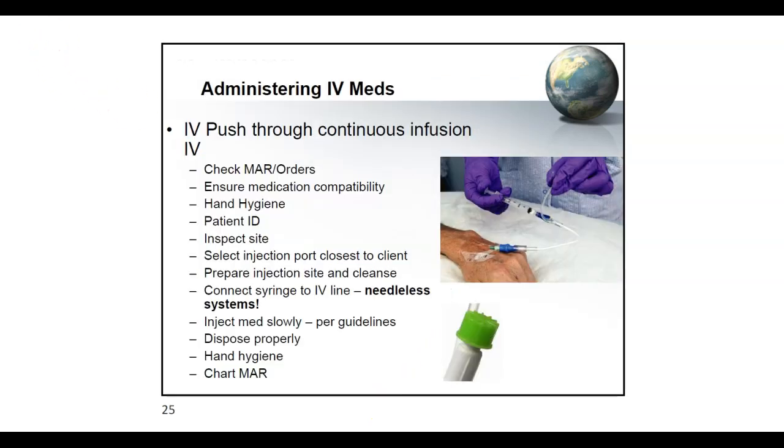Next, let's talk about administering IV medication. We can administer IV push through continuous IV infusion. Sometimes we can also just directly administer it in an IV if there's no infusion going on. But I usually prefer that there's an infusion going because it helps push and move that medication. It also keeps the vein open.